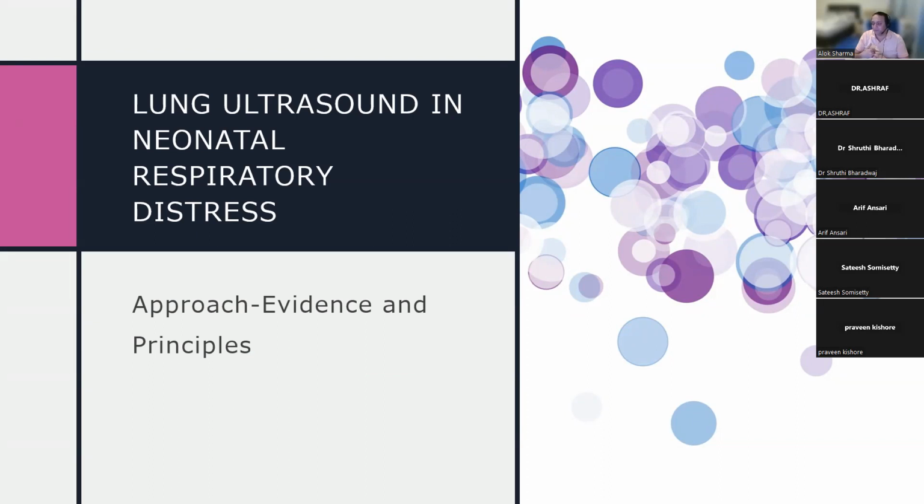In my unit, most babies under 26 weeks will get intubated, ventilated, and have delivery room surfactant. I'm not sure that lung ultrasound gives me a huge benefit in those babies if they have clinically improved and are doing well. But if they're not improving, I'm going back clinically, and lung ultrasound might help me make the diagnosis of a pneumothorax that might need to be treated. So I would think very carefully of how you want to implement it.